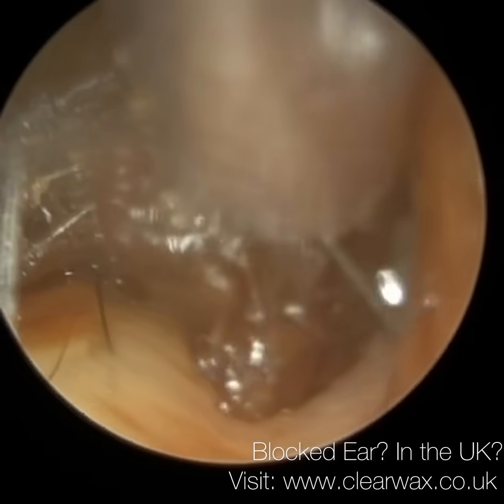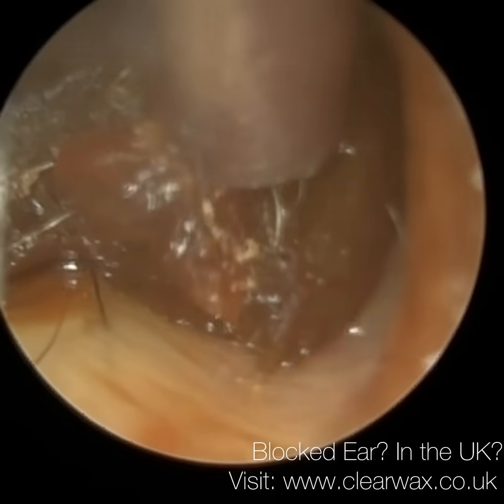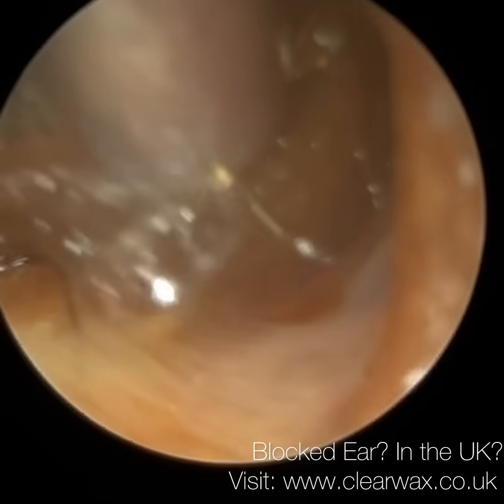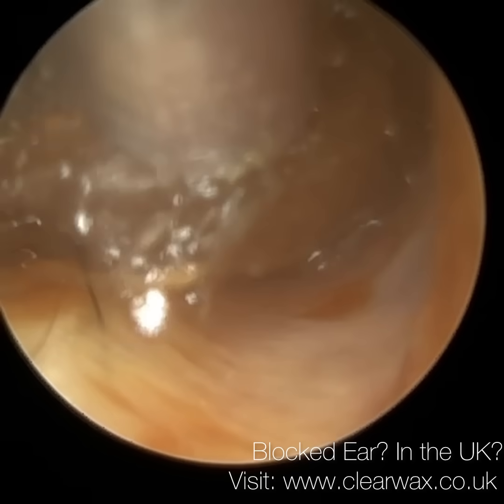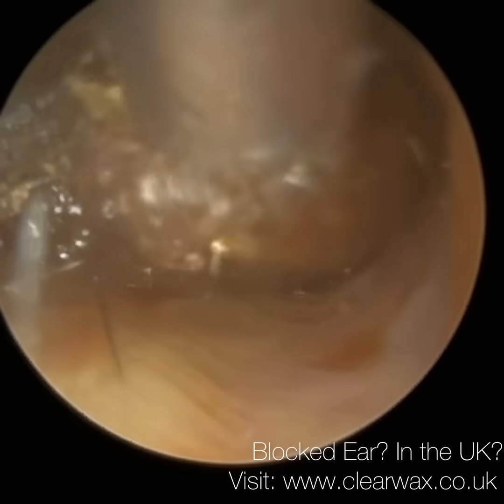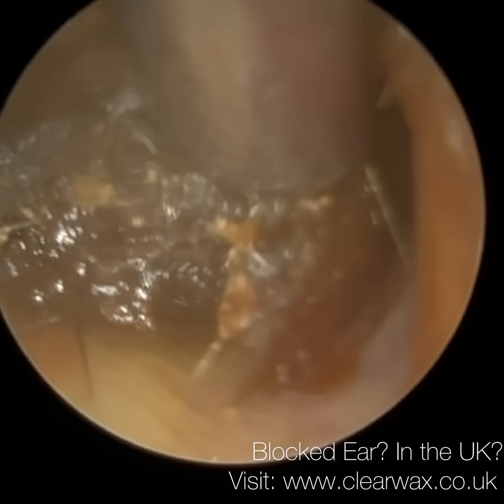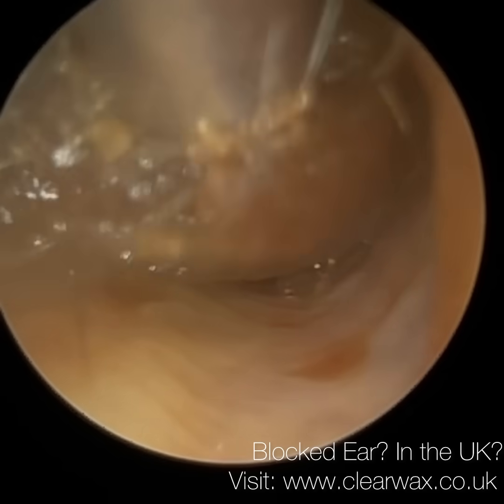Now, the hairs normally, you can see on the right hand side there's no hairs there, so they normally protrude outwards from the first bend, and the hairs are exclusively located on the outer third of the ear canal, the cartilaginous portion, and they're there for a reason. But prior to explaining that, I'll explain the anatomy of the outer third of the ear canal, where the hairs are located.